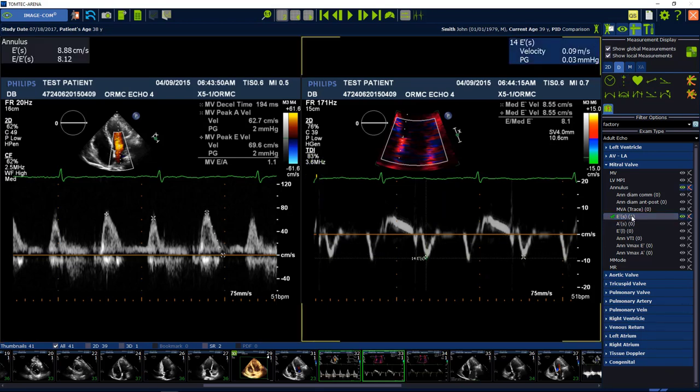If you move the mouse again over the measurement package, the measurements are going to appear in the left upper corner.